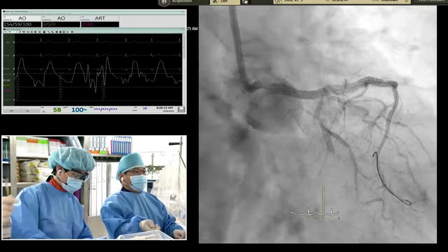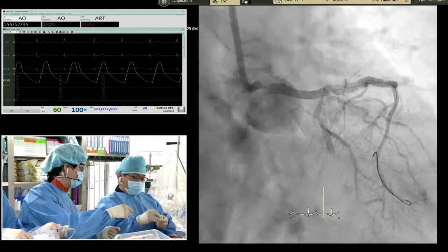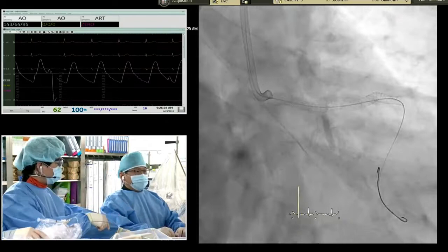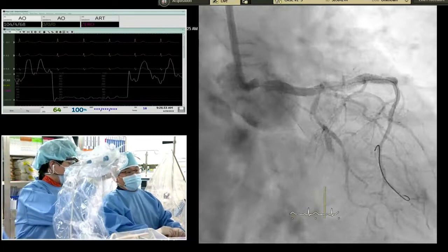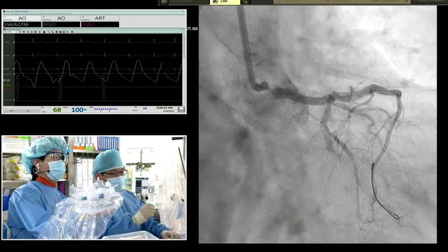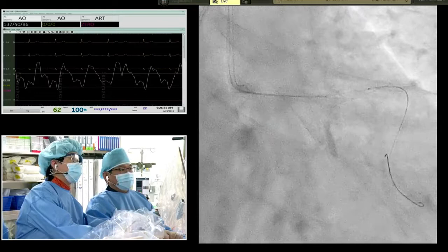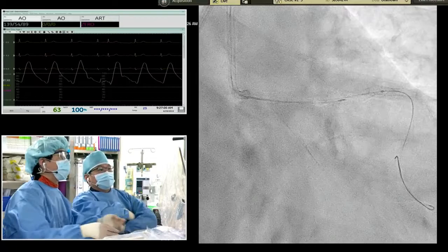We're having a little sidebar discussion about the stent in the ostium of the left main. Are you sure that's properly placed? Usually we go cranial to make sure that's in the right spot. I fully agree with your opinion, but my focus is just the distal overlap. The length is already determined, so protruding into the aorta is not a problem, because I cannot place it more distally if I want to make the minimal overlap. No, I understand that fully. I guess you could change your stent length if you were unhappy with the proximal location, but it's a little late right now. So, Ron, please.